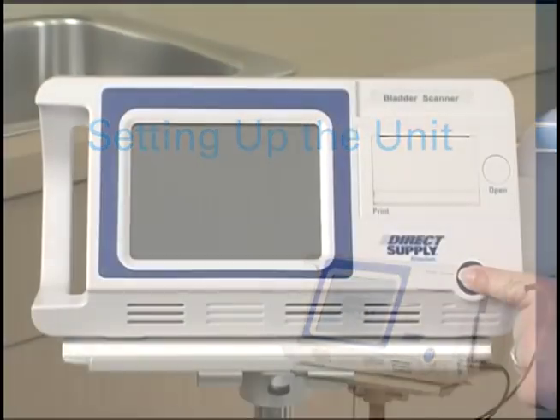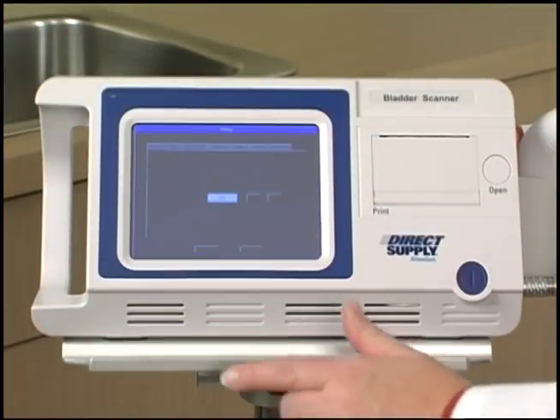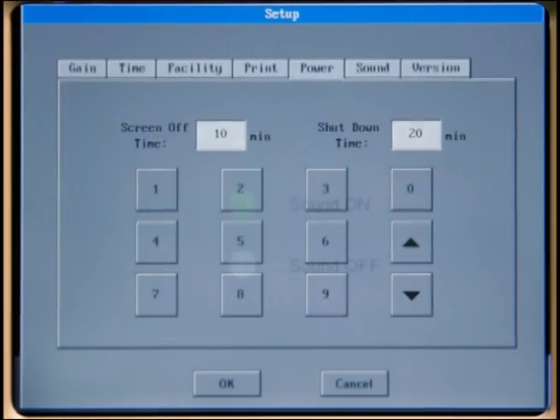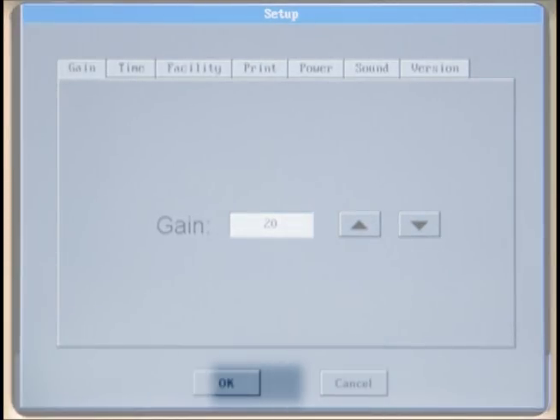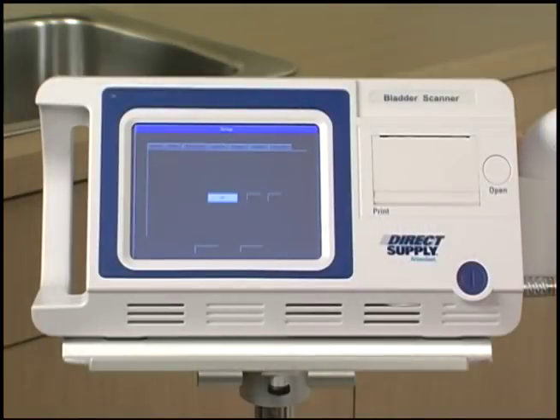Before you can perform a scan, you may need to check your settings. Turn the unit on and then press the setup key on the main screen. This will allow you to access the gain, time, facility, print, power, sound, and version submenus. To save changes to any of these submenus and exit to the main screen, press the OK button. The cancel button exits to the main screen without saving changes. The gain menu controls the system gain — the level of sensitivity the device uses to measure bladder volume. Most users will not need to adjust this setting. Refer to your owner's manual for more information.